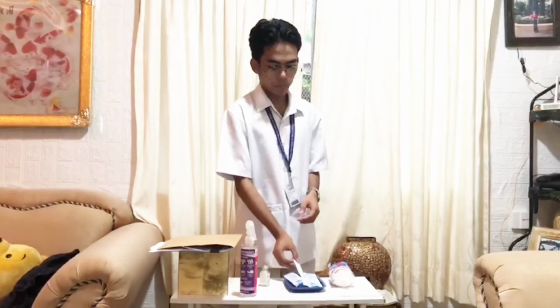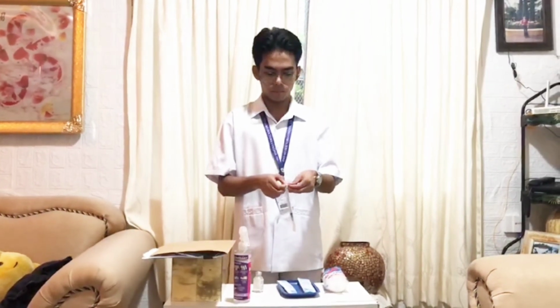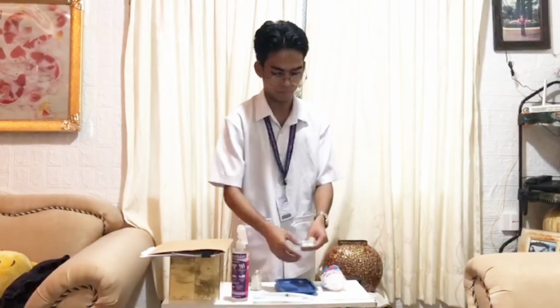After that, I am going to prepare the syringe for the intradermal injection. I have here a tuberculin syringe. Now I am going to open the package. Always remember that we can only touch the barrel and the plunger of the syringe. Now I am going to open the vial and then clean the opening area with cotton and alcohol.